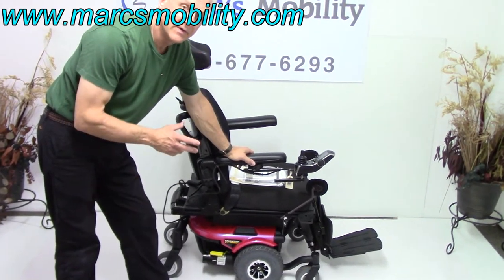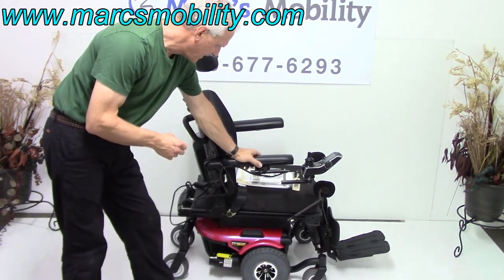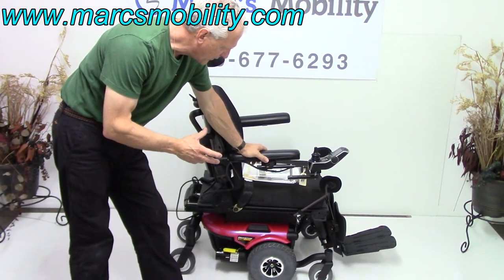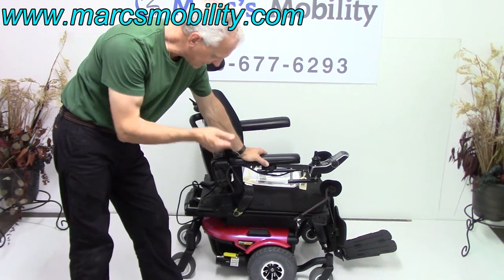This is a Quantum 610 power chair. This is a fantastic power chair. It's practically new — it was used probably for less than three or four months, as you can see.